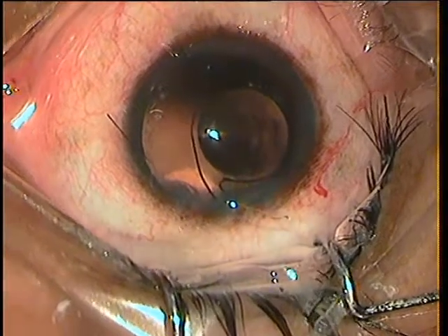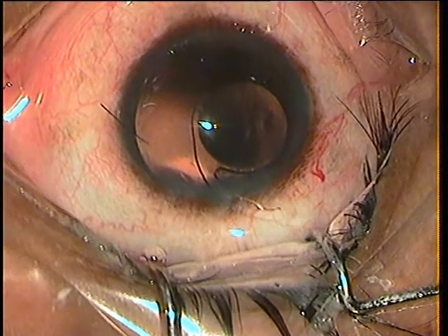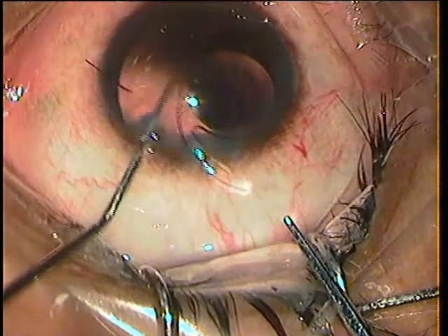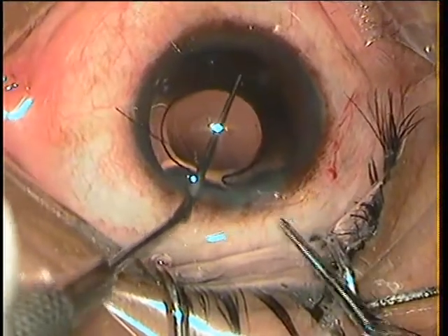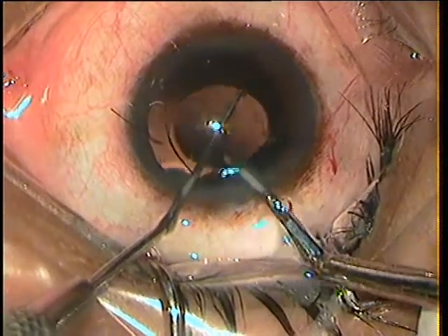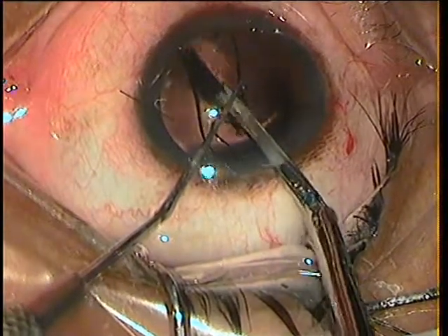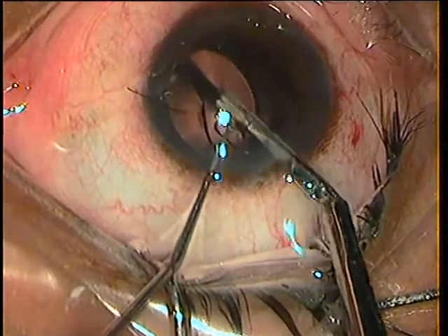Deepening the anterior chamber further. I am using Vannas scissors to cut the lens, with a Kuglen's hook to stabilize it from the other end. The biggest problem here is that if you want to take a bold cut, you will have to open the blades more, and the posterior blade is quite likely to damage the posterior capsule. I cut the legs just halfway to the center.